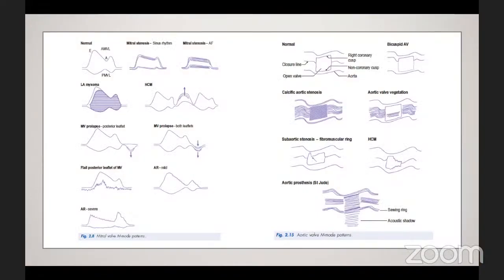The only thing is that this is the fundamentals of echo. This is how echo started, as a single plane, and there are a lot of times when an echocardiographer can diagnose things just based on the M mode. They can diagnose mitral valve prolapse, and they can diagnose aortic regurgitation, just based on the M mode, which is a single plane, as you mentioned earlier. But we're totally moving away from single plane imaging.